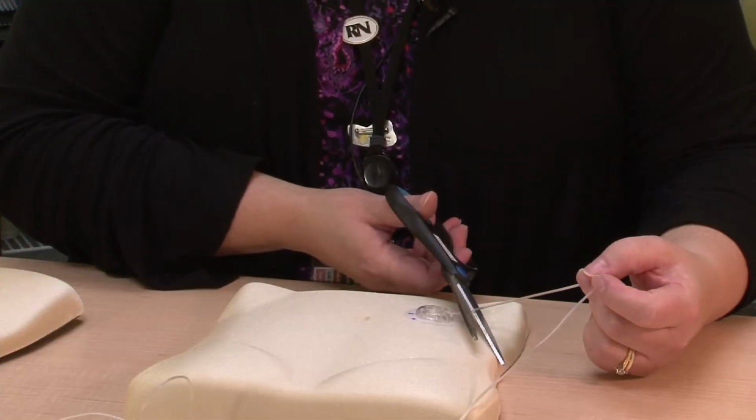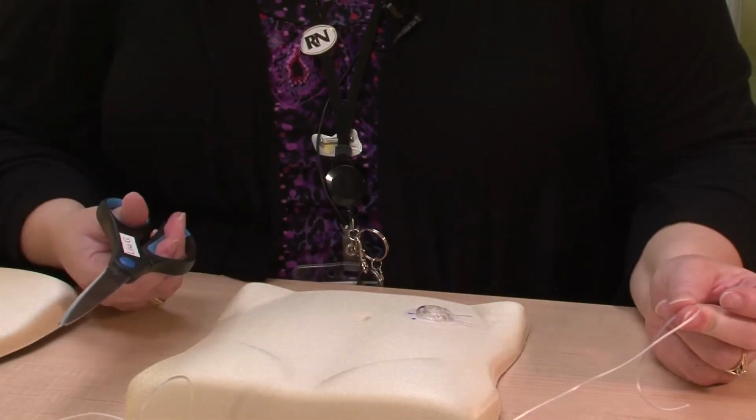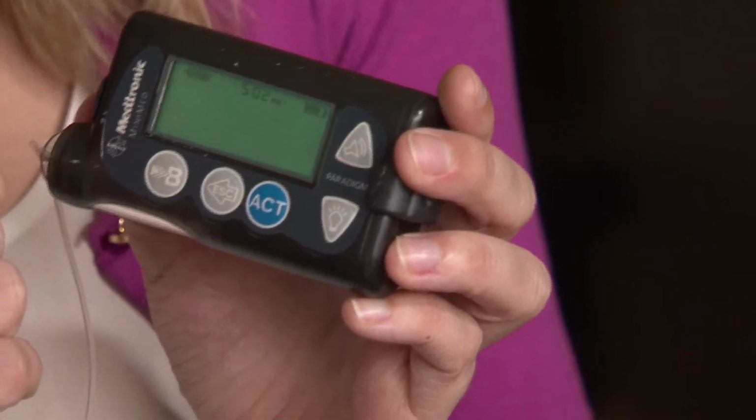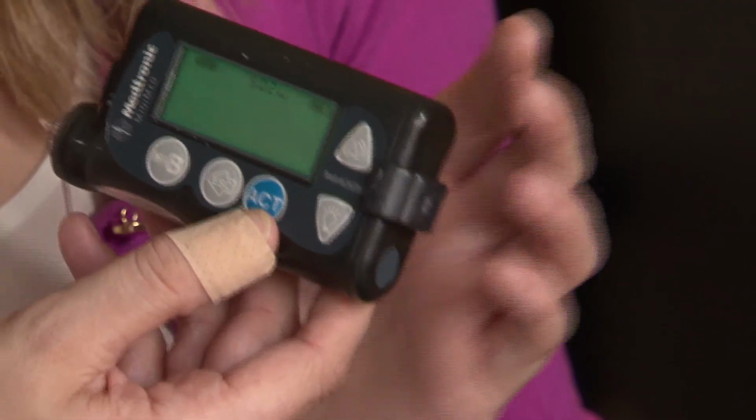I would only snip the tubing if the person is unconscious, unable to cooperate, and no one else is around to help you. I would not get involved yourself with trying to figure out the buttons. You just couldn't know all the pump companies and the mechanisms. But if someone is awake and alert, or there are family members who are present, certainly involve them in the decisions, because they are very capable of helping you out.